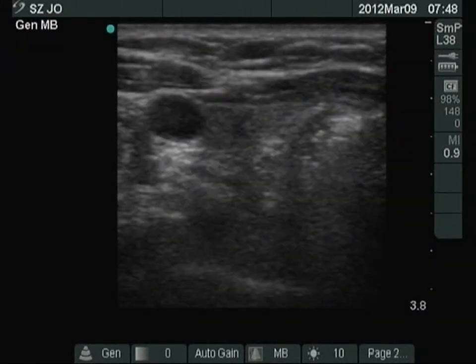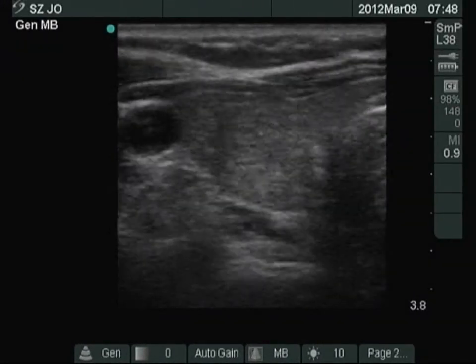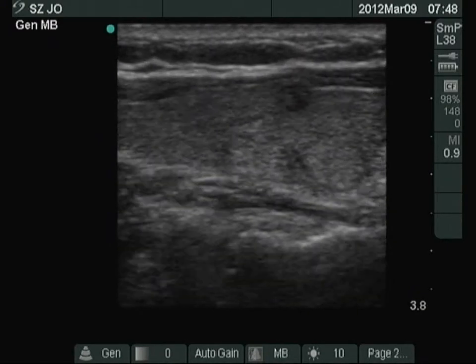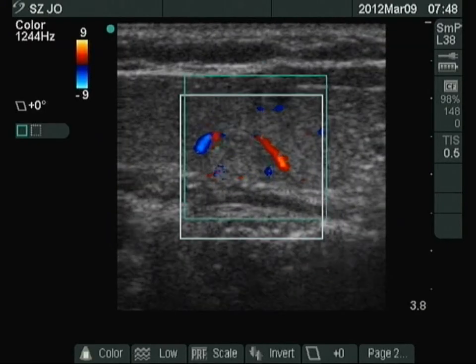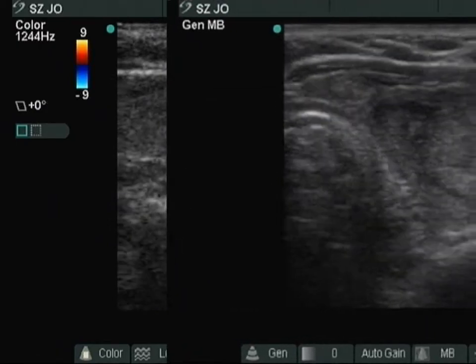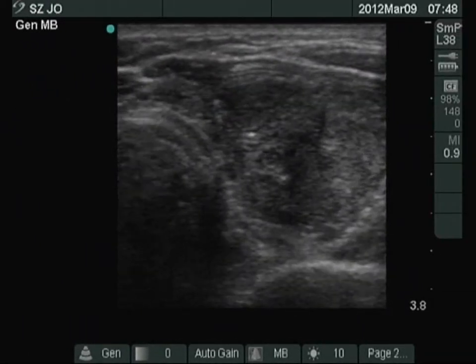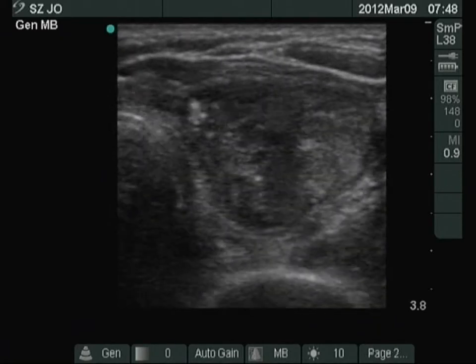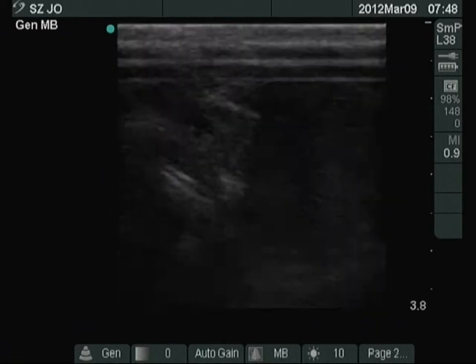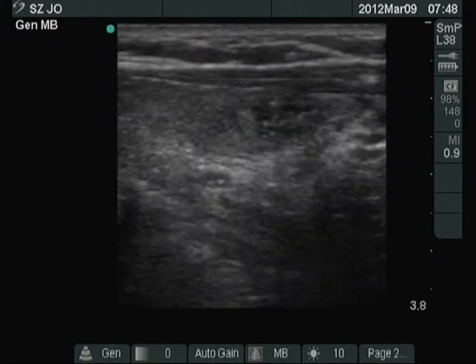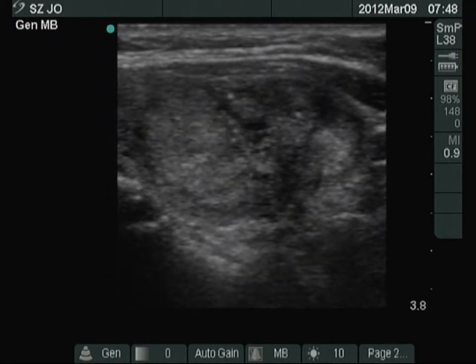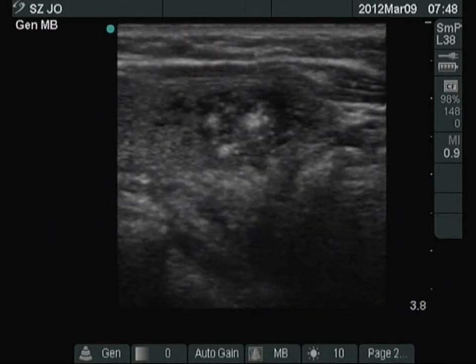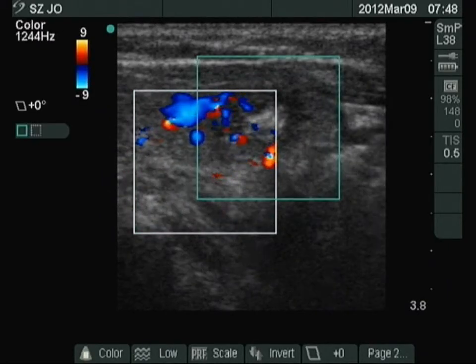Corresponding to lymphocytic thyroiditis, the right lobe is moderately hypoechoic and displays isoechoic and more hypoechoic areas without any oncological significance. The vascularization is not specific. The left thyroid is also moderately hypoechoic. There is a nodule with isoechoic and more hypoechoic areas. The nodule contains microcalcifications and larger hypoechoic patches resembling amyloid deposits of a medullary cancer.